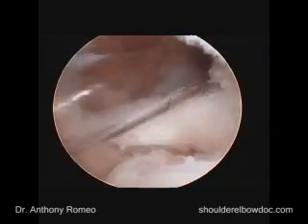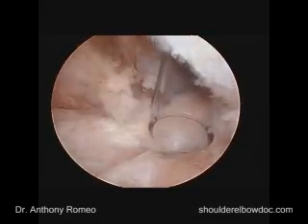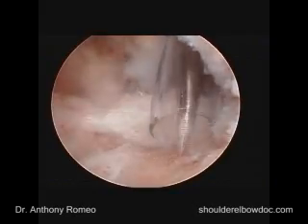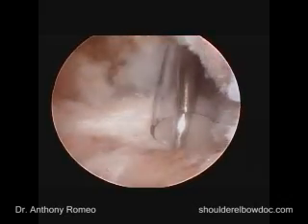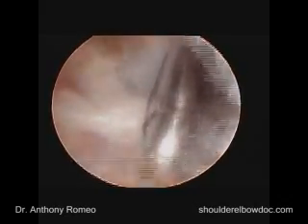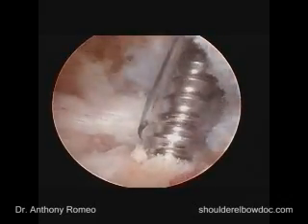We'll start out with our anchor placement, and the first anchor is going to be at the more inferior aspect of the insertion point. As already mentioned, we're going to medialize this slightly. So we'll line this up, and the first thing we'll take is a punch to get this, and we can externally rotate the shoulder just a little bit. This is a very hard bone here in this lady, so we're going to tap the bone to make sure that our anchor doesn't have problems being inserted.